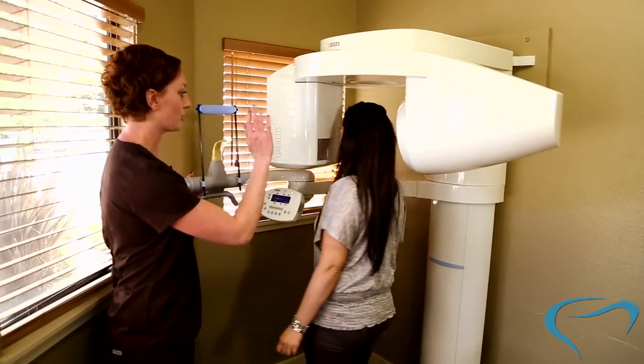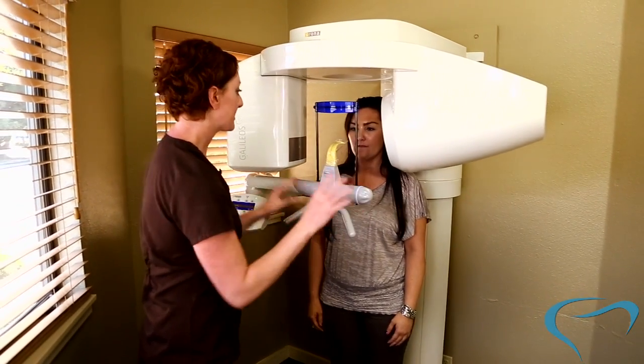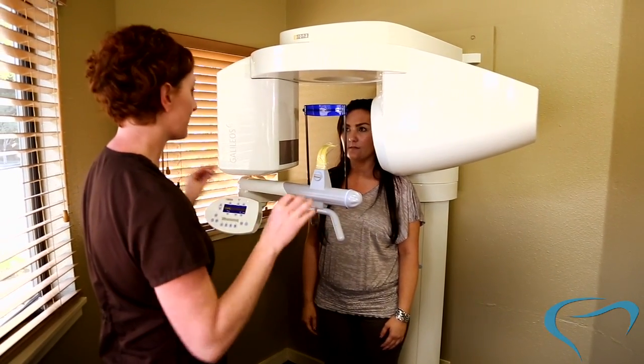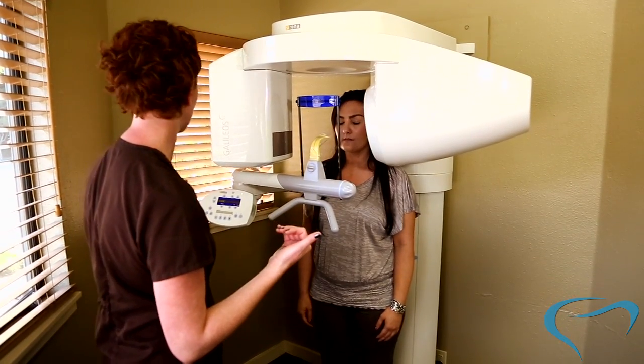I'm going to have you just go ahead and step in, turn around facing me, back up just a little bit. Melissa, this is going to be pretty easy. Most of it is I'm just going to be positioning you, and then I want you to stay real still for me as soon as I tell you to, okay?